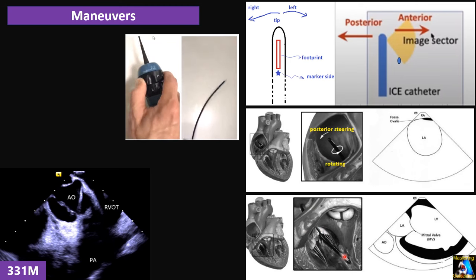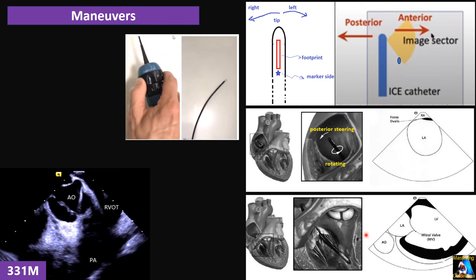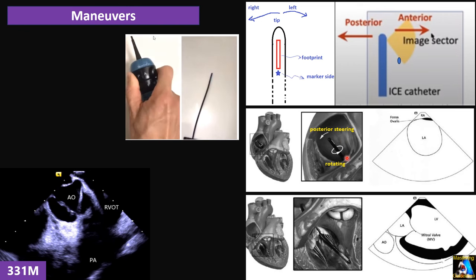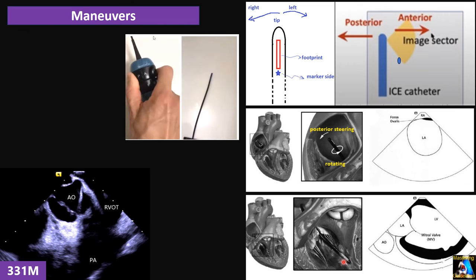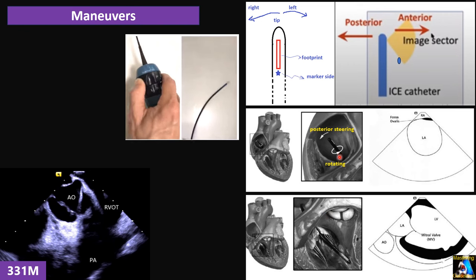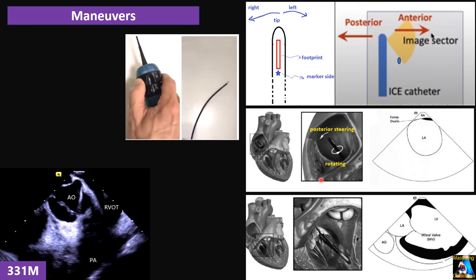So this is advancing. Another is pulling back, or retracting, or withdrawing. And the next one is rotating. So rotating, withdrawing or retracting, and progressing or pushing in. Those three movement maneuvers are very critical. We go over each of the views and which maneuver we use.